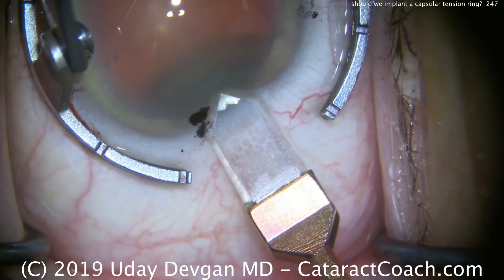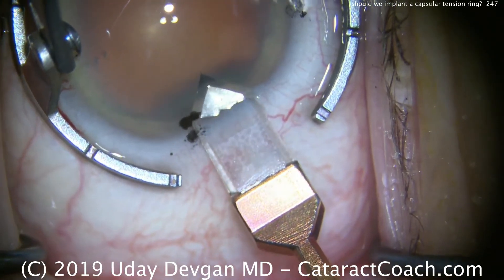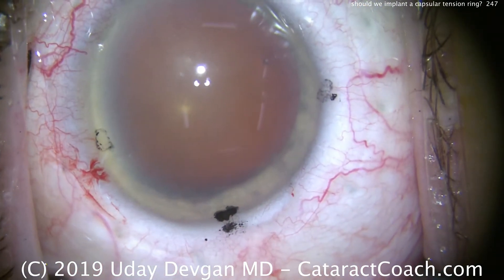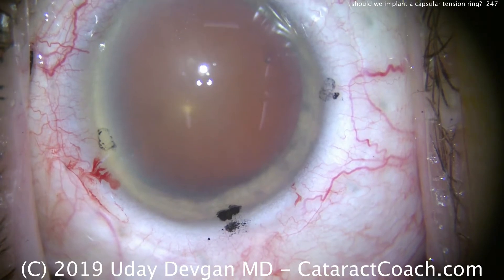Let me show you this case. We're going to fast forward through most of the case to get to just the critical points. There's our main incision made with our diamond keratome, and now we're going to create the capsulorrhexis.